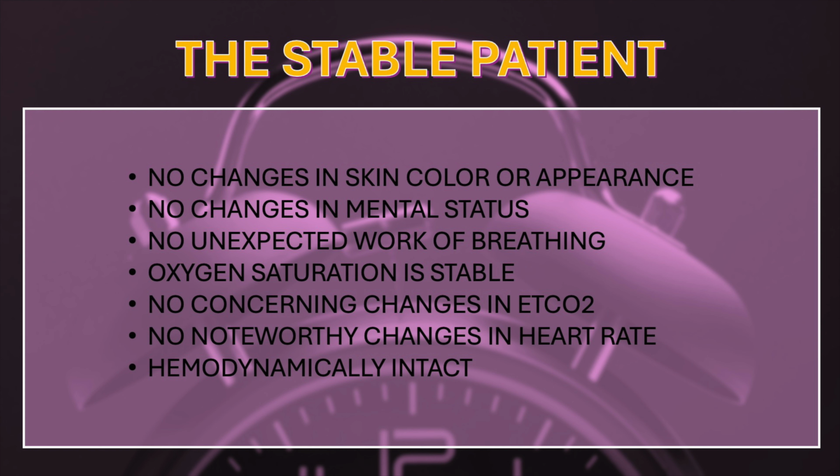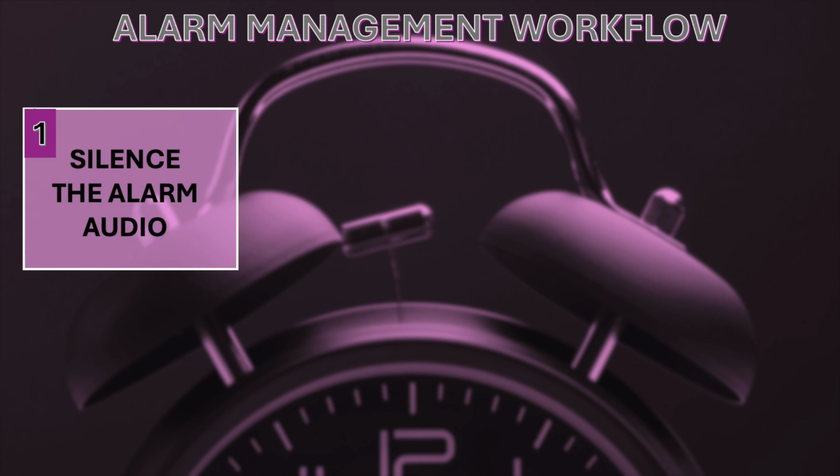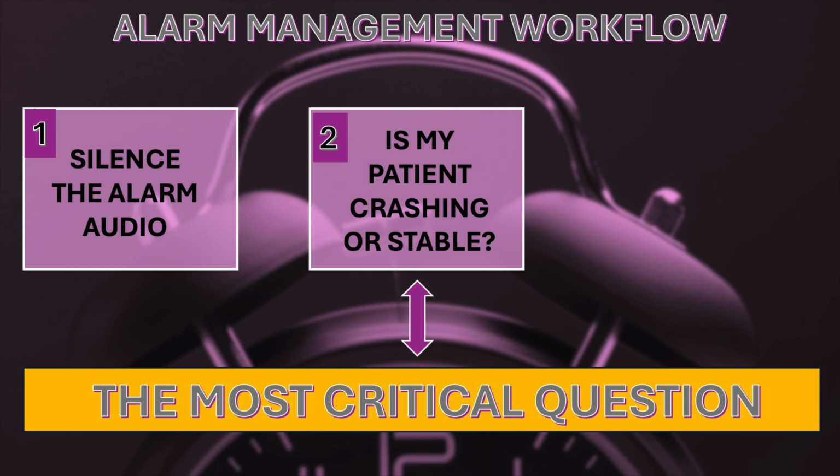Let's review the alarm management workflow so far. The first step in managing alarms is to silence the audio by pressing the audio pause key on the front of the ventilator. Step 2 asks a crucial question. Is my patient crashing or stable? The answer determines what happens next, and for this, we need a scenario.